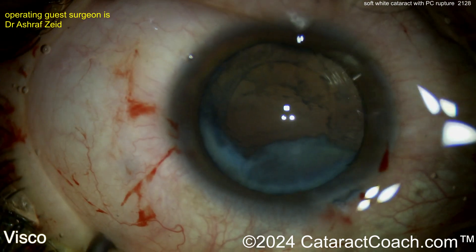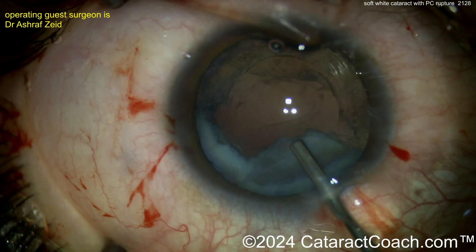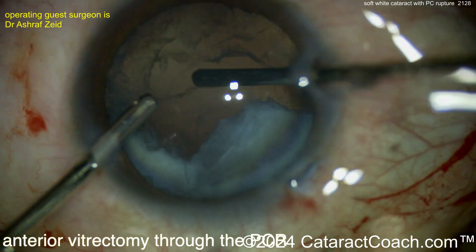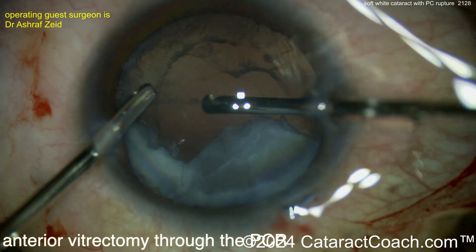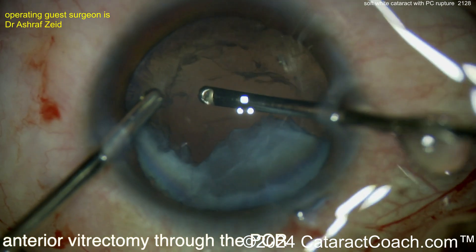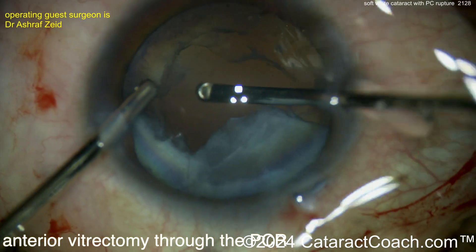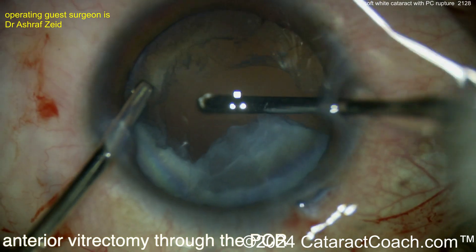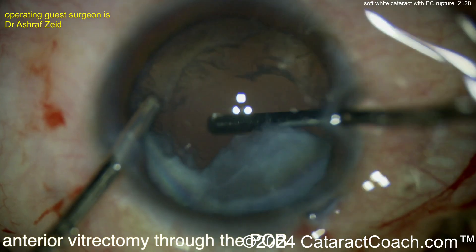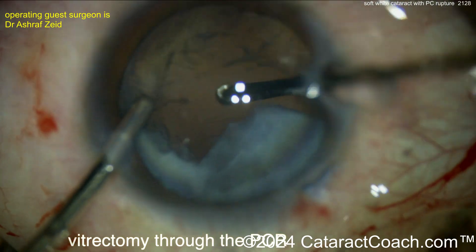You don't want to come out of the eye like this — I'd rather keep the eye inflated, because you don't know the status of the anterior hyaloid face. Viscoelastic is helpful here. A manual vitrectomy cutter, probably 23-gauge, is going inside to clean up any prolapsed vitreous. Remember, we can often prevent prolapse of vitreous by using viscoelastic to prevent the anterior segment from collapsing — if you let AC pressure go to zero, the vitreous cavity pressure is higher, so you will get vitreous prolapse.